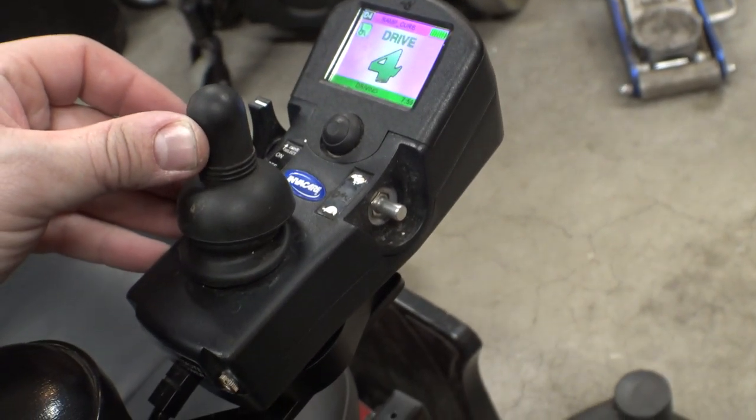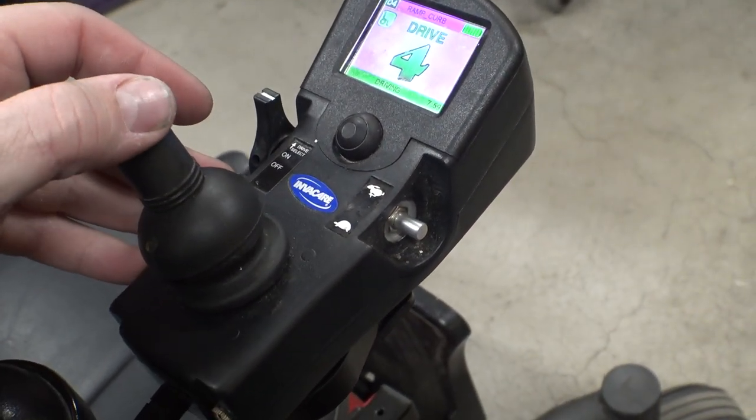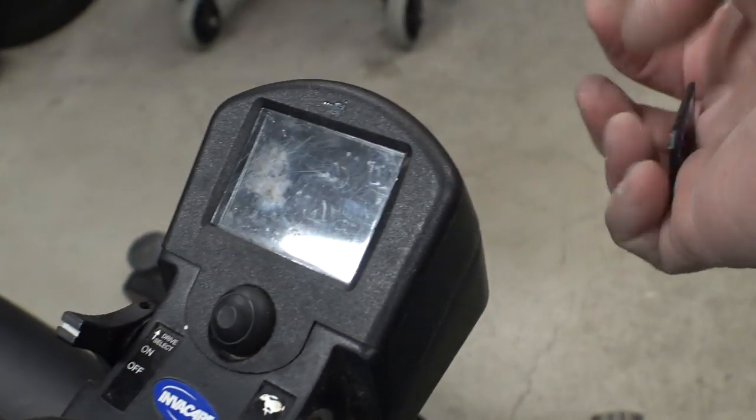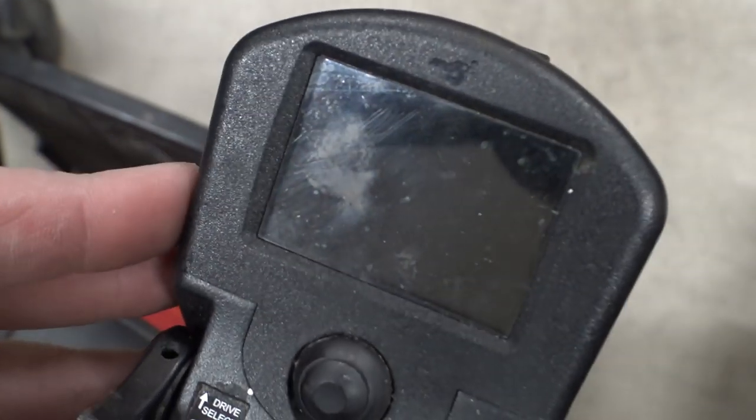I swapped the connectors back and now forward/reverse and left/right are backwards. So I'm going to change it in software — I essentially reversed all the axes so forward is reverse and right is left. We're going to try saving this. I've never attempted this before, but let's see if it actually works. In theory this should reverse it all. I'm assuming that's why those settings are there, but we're about to find out. This is the kind of stuff that I do to test things out and see how they work.